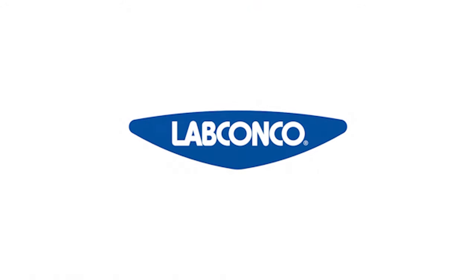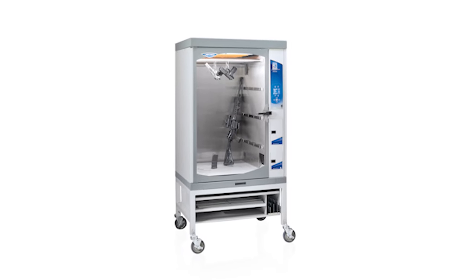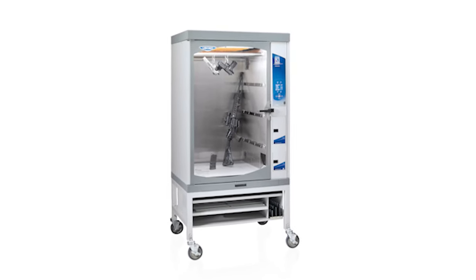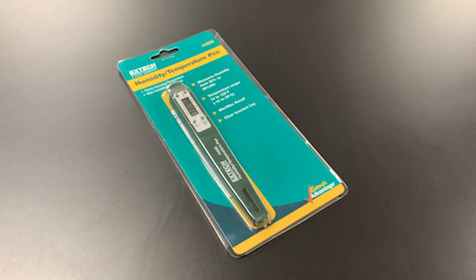This video will show you how to calibrate the relative humidity sensor on a LabConco CaptureBT. This procedure should be done every three months. Each unit is shipped with a hygrometer, or you can use your own calibrated hygrometer.